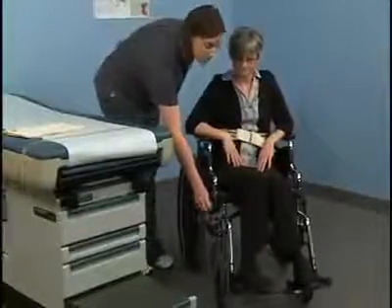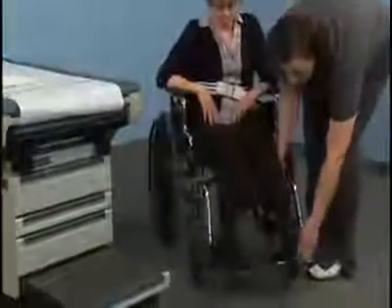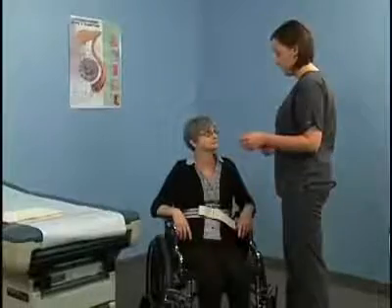Lock the brakes of the wheelchair to prevent it from moving during transfer. And fold back the footrests to clear the path for making the transfer. Make sure the patient's feet are positioned flat on the floor. Tell the patient what to do during the transfer.